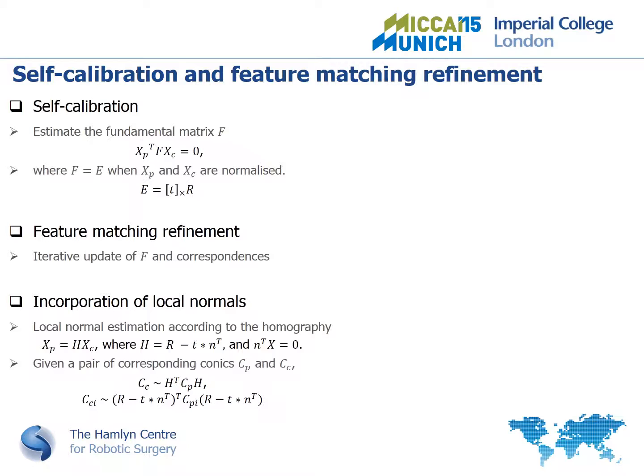However, in clinical applications, the relative position between the probe and the camera can change from time to time, and applying a normal calibration to determine the relative position once it changes is time-consuming and infeasible. So we propose to use the self-calibration method for surface reconstruction.